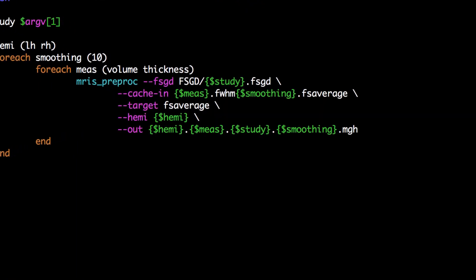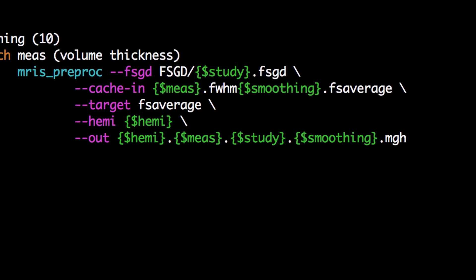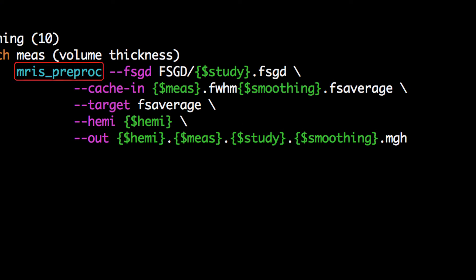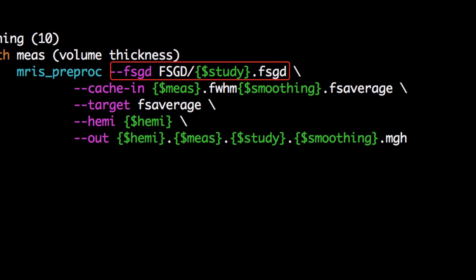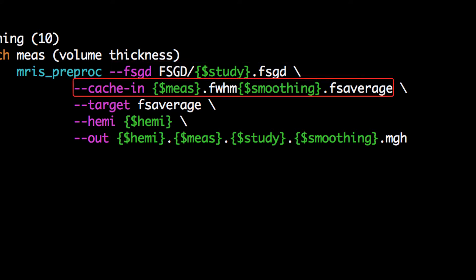Nested within these loops is the command mri's preproc. It requires the FSGD file we created in the previous tutorial for a list of subjects, and then loads the smooth files from the Qcache command.